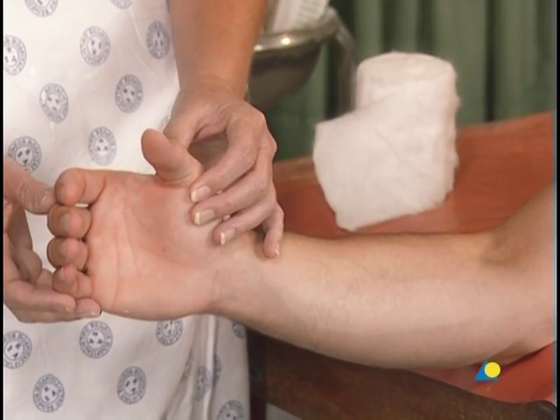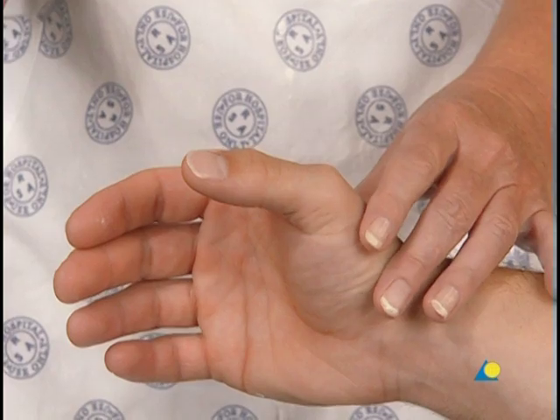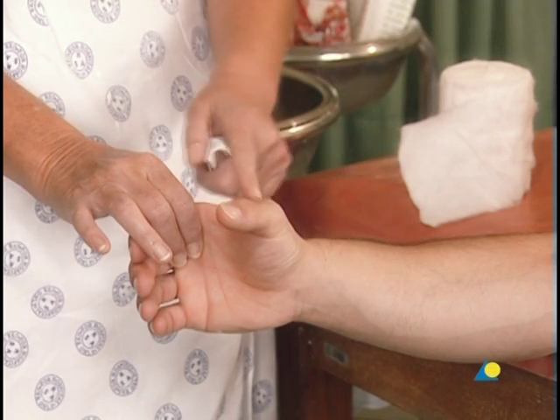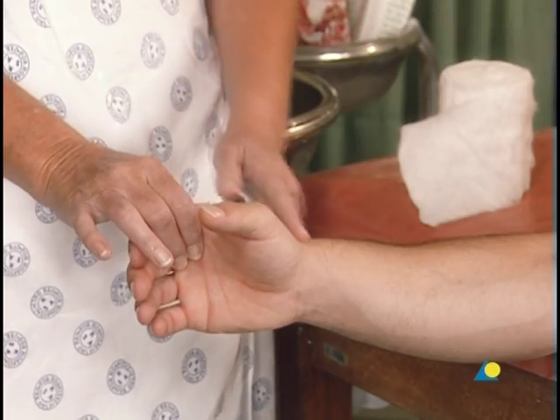The thumb, up to the nail, is included in the cast. The patient's hand is positioned as if holding a glass, giving a slight dorsal flexion of the wrist. The phalanx, metacarpal, and radius should remain in line.